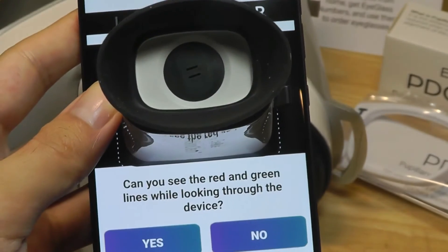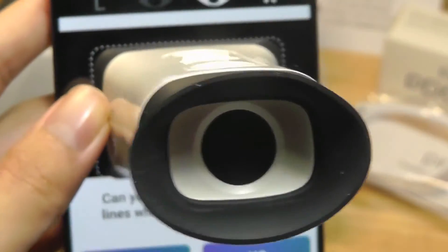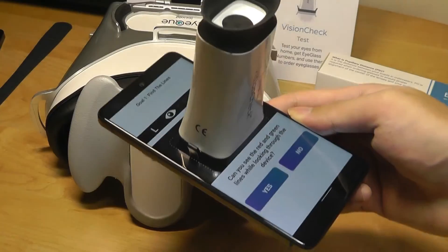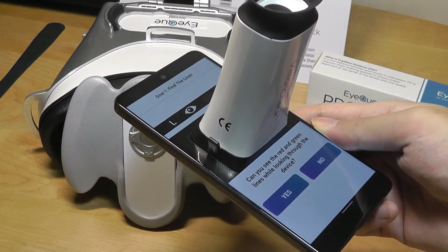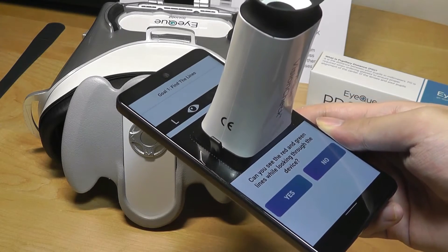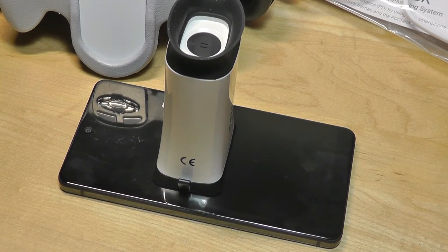What you see in person is like looking through a VR goggle — you can see a letter and a faint line, and if it's not clear you adjust focus using the two keys. There's an audible sound and a haptic vibration engine that buzzes as confirmation when moving things around. As for accuracy, results seem pretty decent, though sometimes slightly higher than results from the doctor even with three averaged tests — but not by much. It makes sense for iQ to lean toward slightly more aggressive results, and the margin of error is reasonable, translating well into glasses similar to my actual prescription lenses.